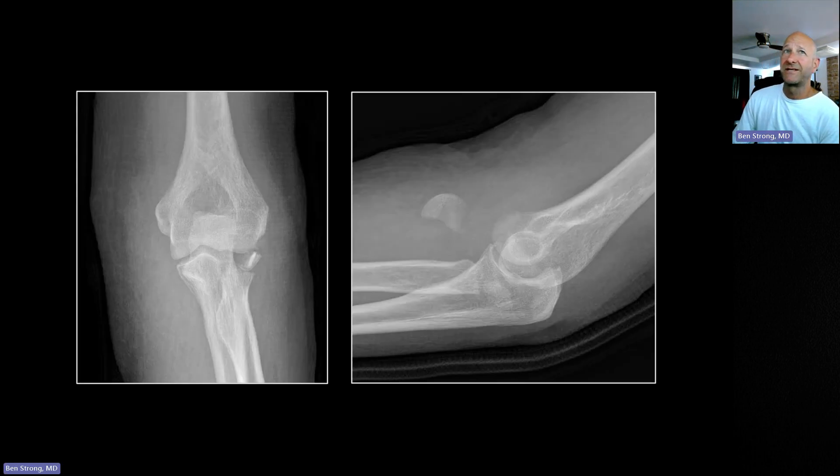Not everything circular is a capitellar fracture. Here the radial head is actually missing — it has sheared right off, with a fragment visible, and is rotated and anteriorly displaced quite dramatically. The frontal view is a real fooler here: it looks like the radial head is still sitting in position, but because the beam is coming straight through, that dramatic anterior displacement is simply not apparent on the frontal view.